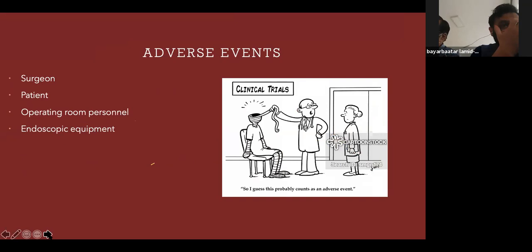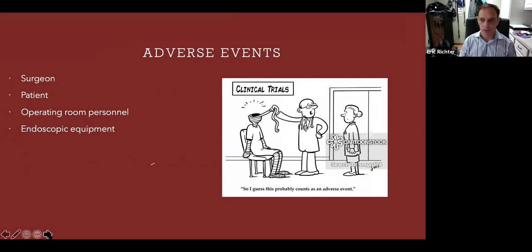Okay, next. So adverse events, okay? There can be adverse events to the surgeon, to the patient, operating room personnel, and then even your equipment.